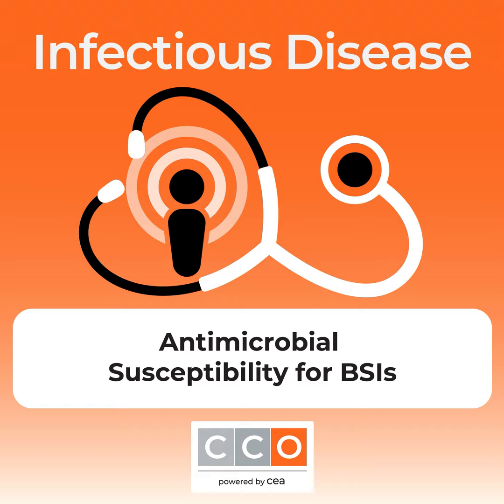It reduces mortality if used with antimicrobial stewardship oversight. It is associated with decreased hospital length of stay when used with the antimicrobial stewardship program, because we need that communication. In our facility with EPIC, we have an in-basket. Every time, that result automatically triggers to the antimicrobial stewardship team, and they're able to do the intervention.